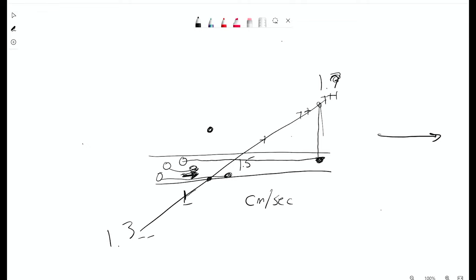It's going to see this magnetic field strength and nothing else. It's not moving, right? So it's going to stay moving the same speed as itself. So if we make a clock face, it will have no phase shift. It never got, it's exactly where it's supposed to be around the clock face.